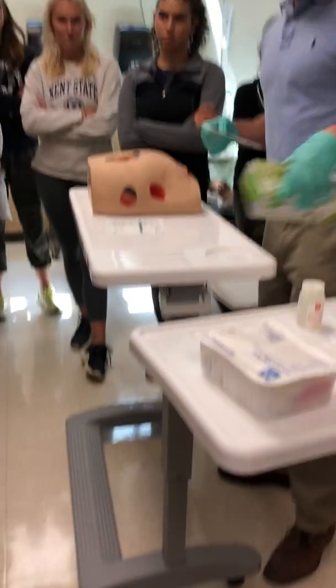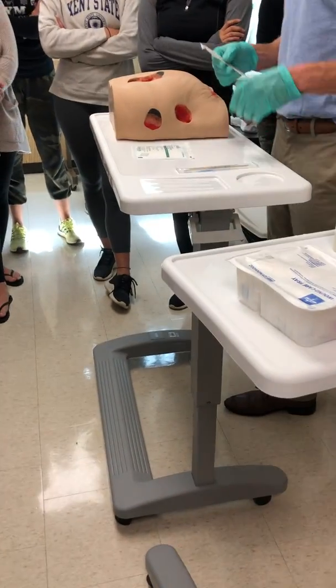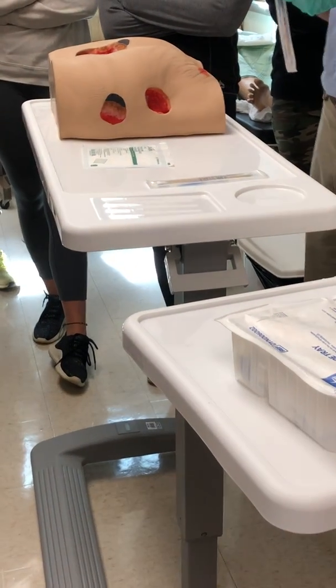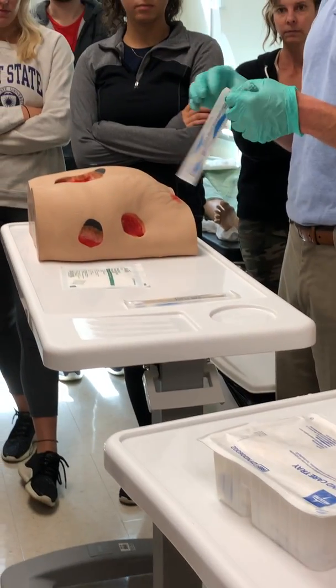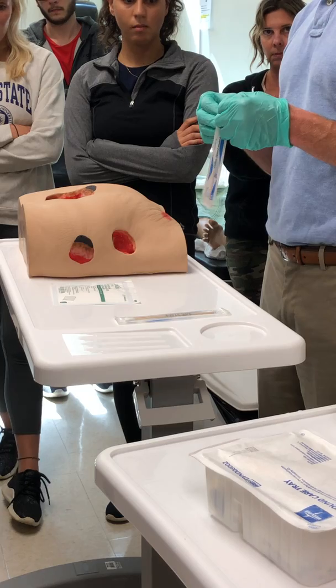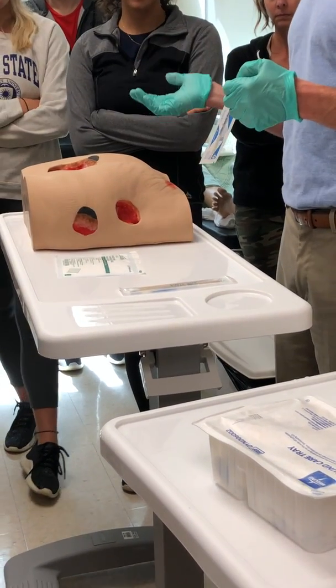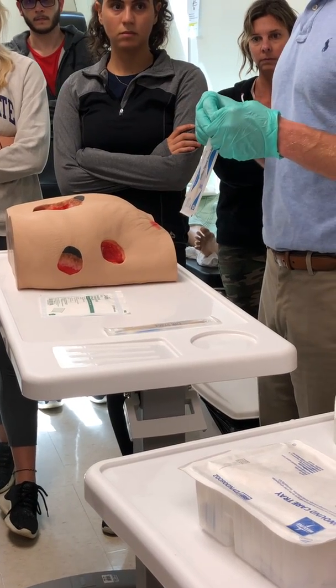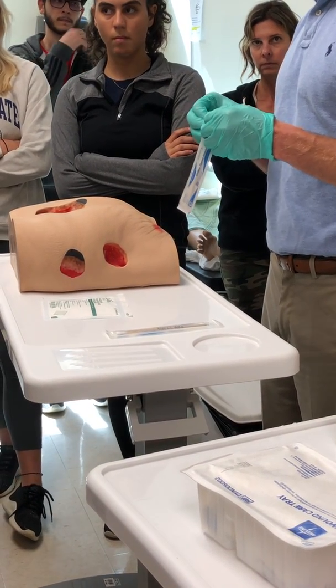Thank you. Okay. So the first thing I do is measure my wound. There are a bunch of different measurements I need to do: width, length, depth. This wound has tunneling and undermining, so I have 5 different measurements I need. And then I either need to have someone in the room with me to write them down, or I need to take my gloves on and off, writing them down as I go, because I'm not going to remember 5 different measurements, okay?